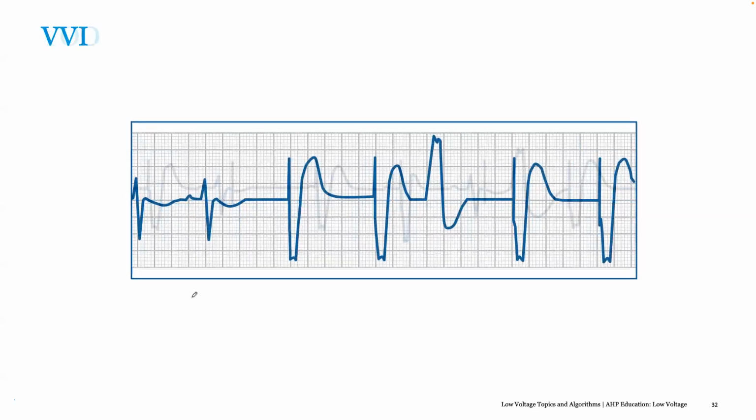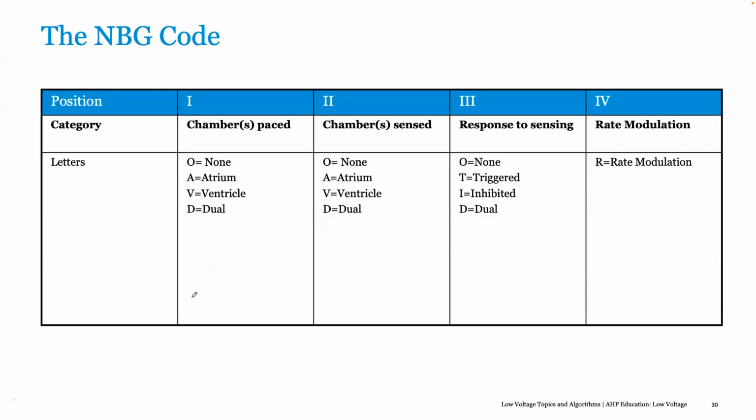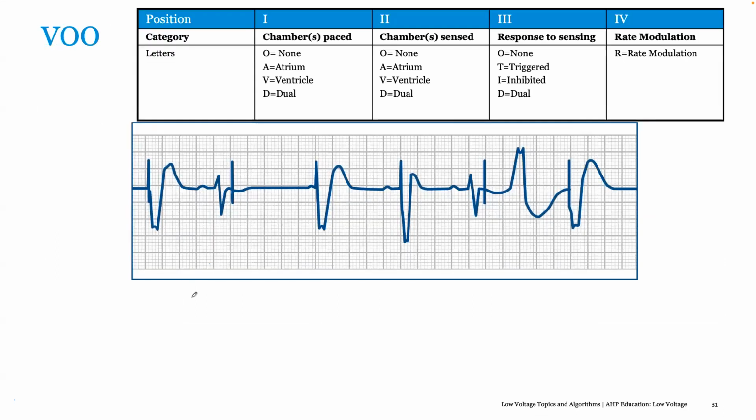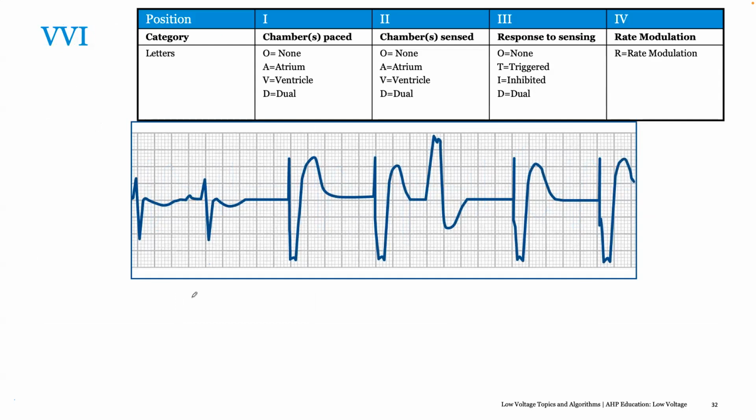It'll make your pacing percentage look a bit better, but there is still a lot of research that needs doing on how effective this truly is. My opinion is it's not hugely effective. It's good for making the numbers look good, but is V-sense response truly going to be advantageous as compared to BiV pacing? So there is a mode, in VVI, as I said, where you can have this V-sense response turned on, which I would commonly do.